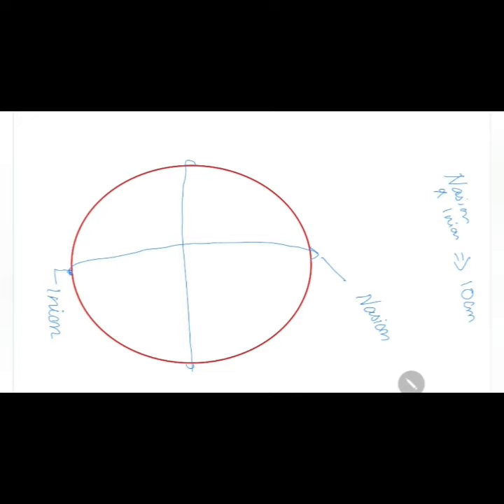How we are going to place the electrodes is with a distance of 10 percentage first, then 20 percentage, then 20 percentage, then 20 percentage, then 20 percentage, and then 10 percentage. So we are going to use 10 and 20 percentage. That is the reason why this system is called the 10-20 system. So 1 2 3 4 5 6. Now we are going to place the electrodes.